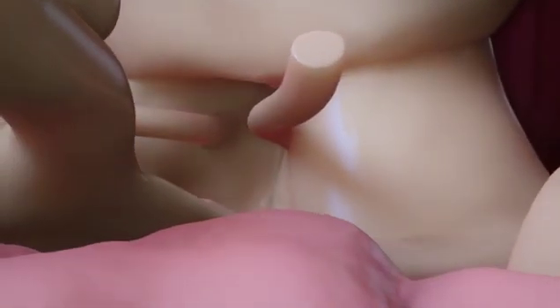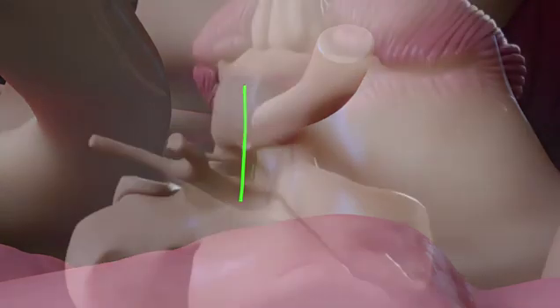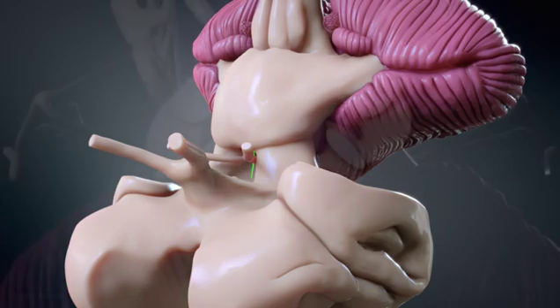Alternatively, an interpeduncular safe entry zone can be used. This approach is ideal for lesions located in the centromedian midbrain and makes use of the relatively sparse fiber density located in the midline of the midbrain. The interpeduncular safe entry zone is generally approached using the contralateral orbitozygomatic approach and dissection between the basilar perforators, mobilizing them and placing a small opening into the brainstem in between these perforators, which allows the surgeon access into the centromedian portion of the midbrain.